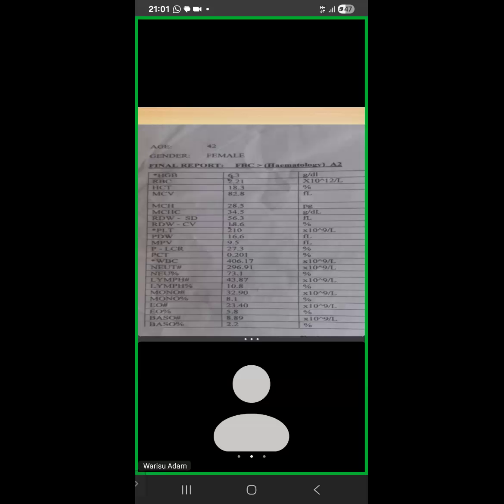We just did workups in hematology. Yes, we are doing workups. Okay. So this one, if the count was not very high, I would have recommended NAP score too. But because it is very high like that, I don't know if that will be necessary.